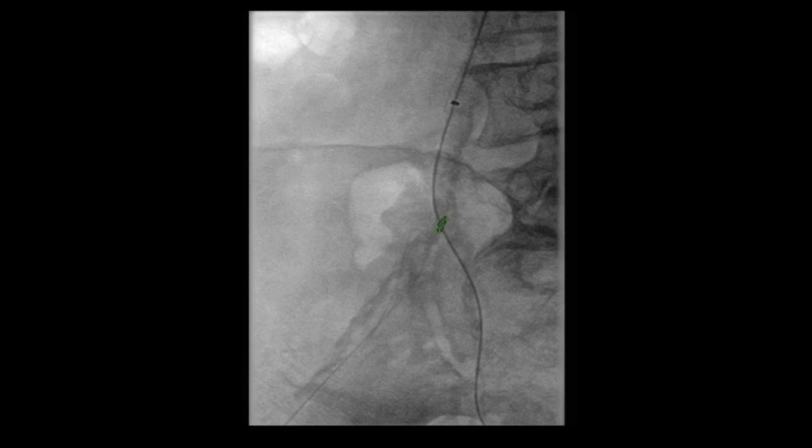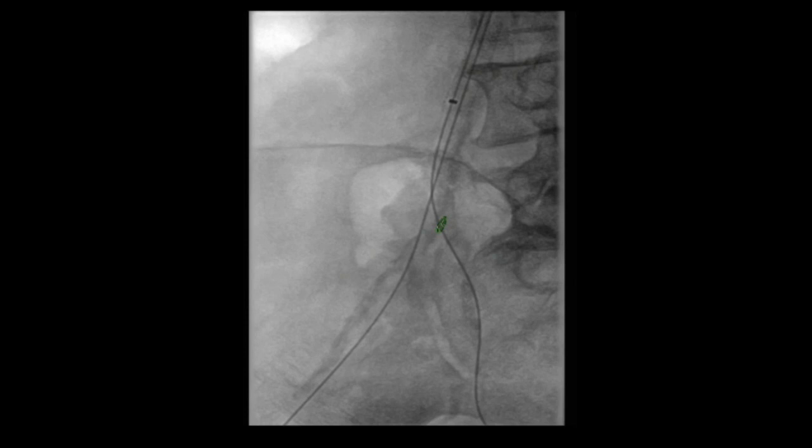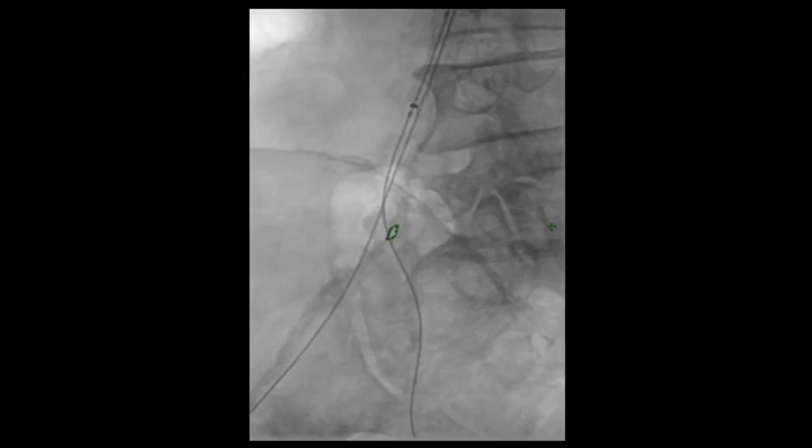The plan was to place a VBX stent into the internal iliac artery. Obviously we did not want to compromise the external on that side, so we accessed the right groin and placed a wire retrograde. Using this technique we wanted to protect the external iliac artery. We brought a 6x4 balloon down to further dilate the orifice and facilitate subsequent passage of the stent graft.